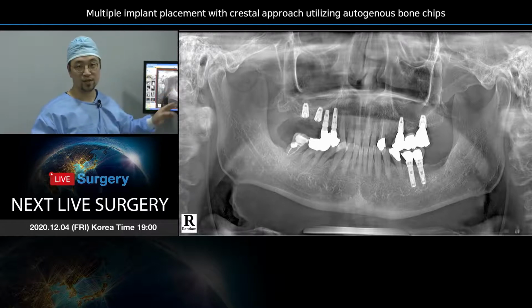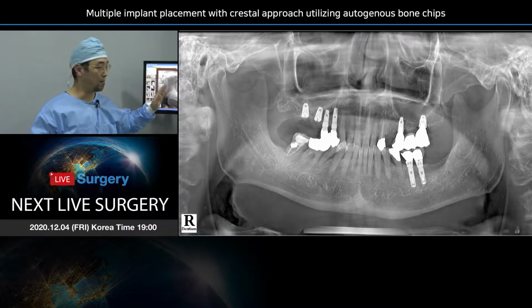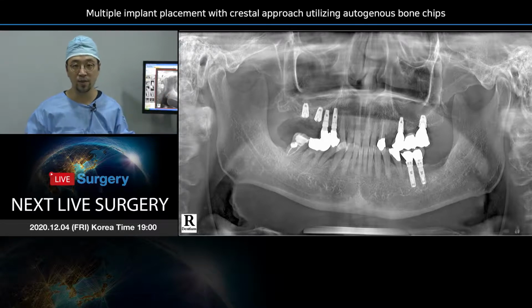On the other side, these are 2 implants that I placed today. I tried to place 2 parallel implants, but actually I get the misinformation from the uneven bone. Then the tooth number 17 is slightly medially and distally angulated around 10 or 20 degrees. But later we can fix that at the prosthetic procedure. So at this point, the most important thing is the primary stability for the prosthetic process. And today we have achieved a great primary stability, and also the GBR.